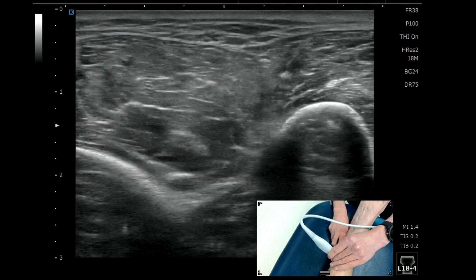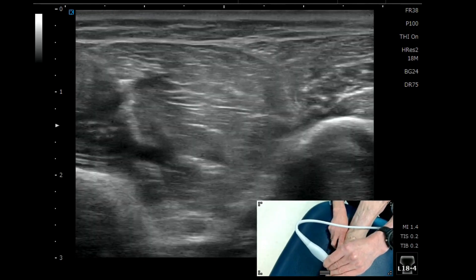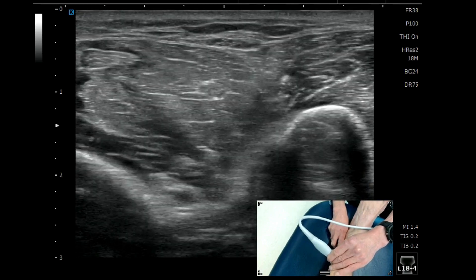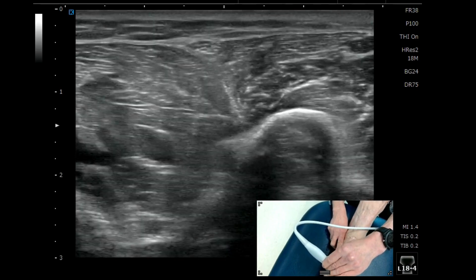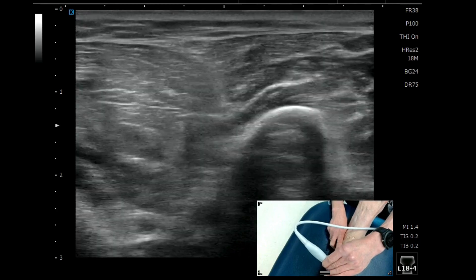In order to identify where it goes deep to the fascia, we scan upwards and we can see the nerve going deep to it. Then we go more distal again and we can see it piercing the fascia. This is a really nice and quick way to identify the superficial peroneal nerve and get it every single time.